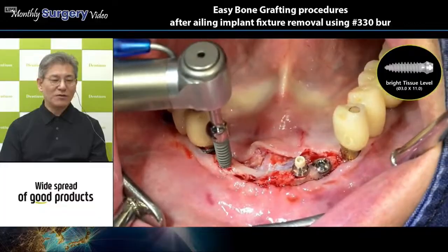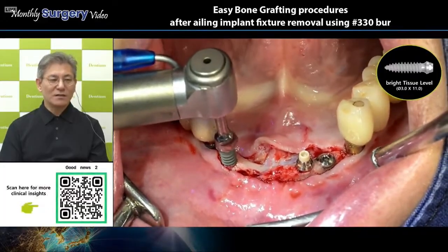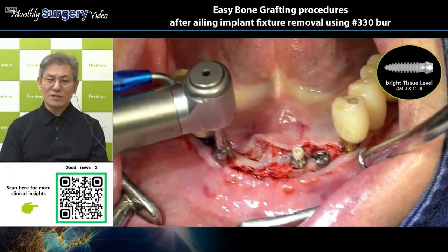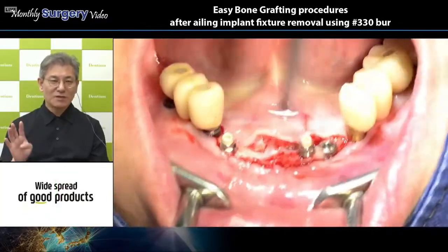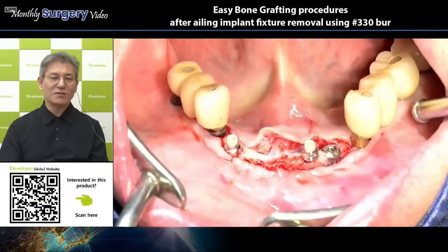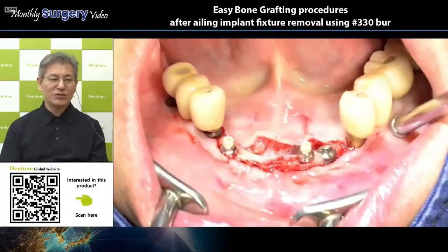Now, diameter 3.0. The excellent installation. The osteotomy procedure is so simple. Did you see the drill procedure? High-speed bur, small indentation, Lindemann 1, and final drill, and then installation. Just 3 drills and implantation.